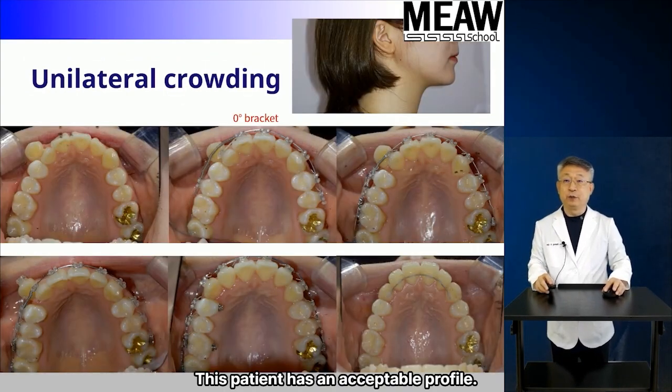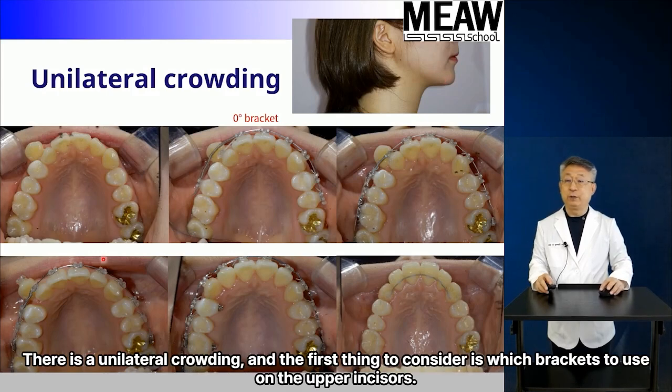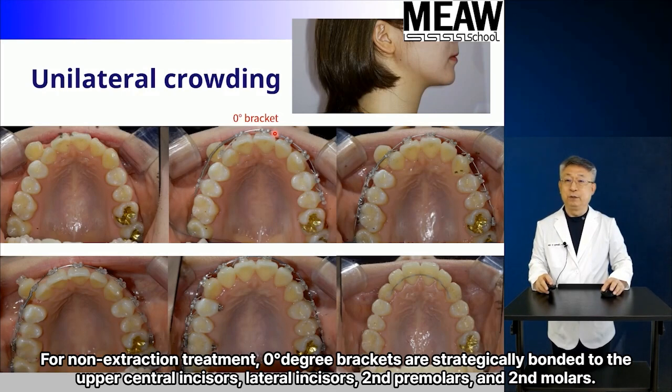This patient has an acceptable profile. There is a unilateral crowding, and the first thing to consider is which brackets to use on the upper incisors. For non-extraction treatment, 0-degree brackets are strategically bonded to the upper central incisors, lateral incisors, second premolars, and second molars.